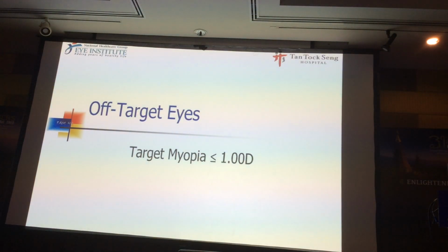Now, off-target eyes. Now we do monovision. Do they perform the same? All of us target emmetropia. Emmetropia is easy. Most formulas are good. But once you target off by 1 diopter, looking at 1 diopter or more, and all these are myopia because nobody targets hyperopia today because the surgery is so safe. We go for early sequential surgery rather than try to correct for anisometropia.